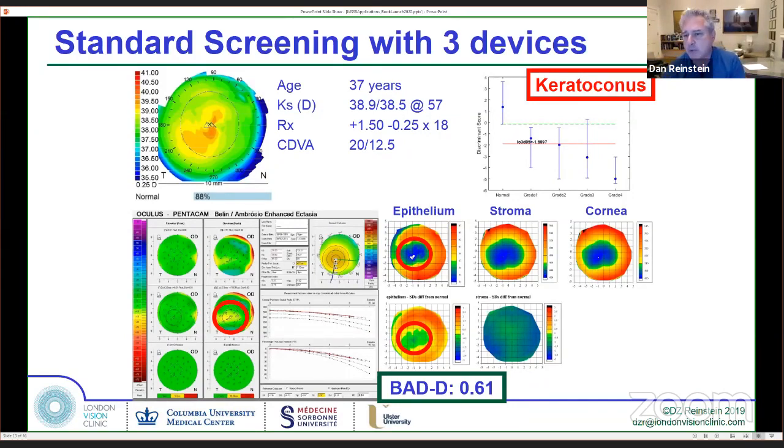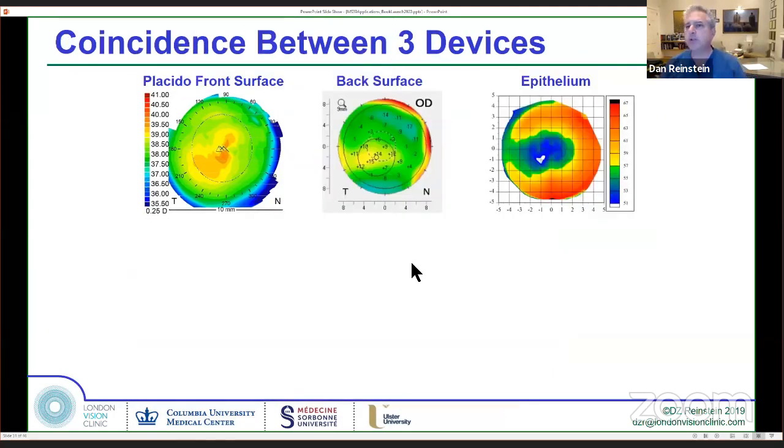And in our study, which I showed you, we demonstrated a 7% increase in our total LASIK volume, because 13% or 16% of all of the cases we thought were suspect, in fact, were not keratoconic once we looked at the epithelium. So this is a critical, critical thing.